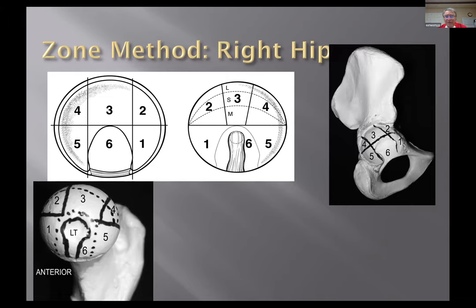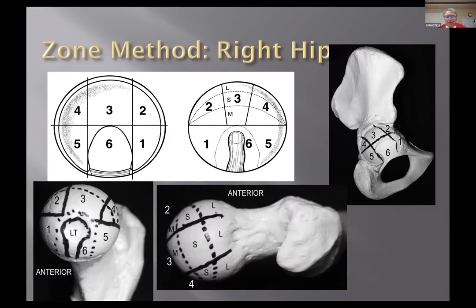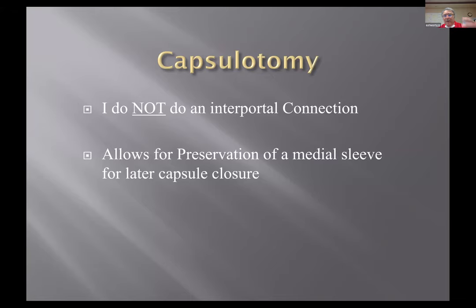So the nice thing about hips is they're dynamic procedures. You can move the leg, you can watch that cam lesion bang against the acetabulum and go, boy, it looks like it's rubbing there. And again, given the area that you need to see, you then need access to the hip. Different ways to open the capsule is really surgeon dependent.